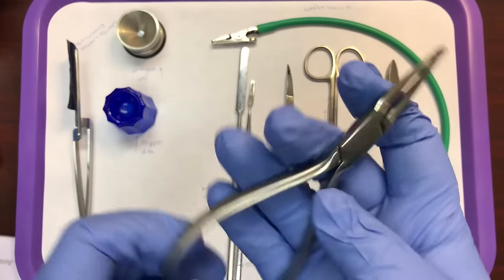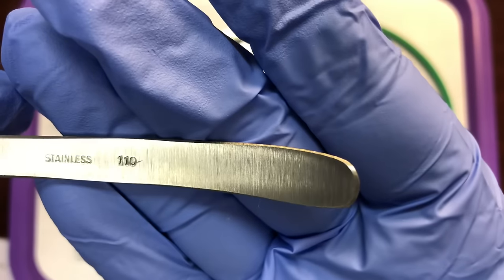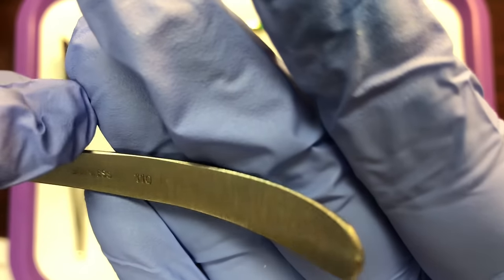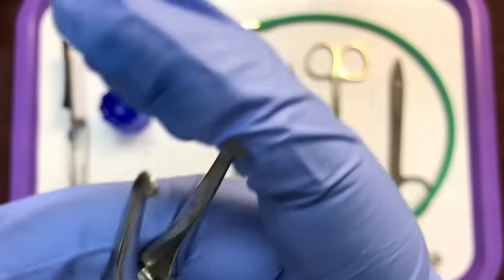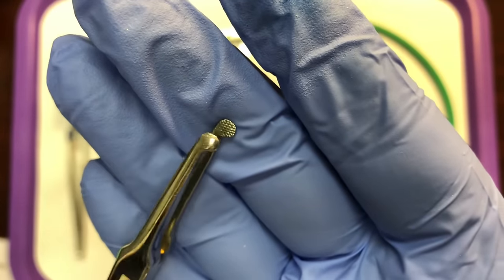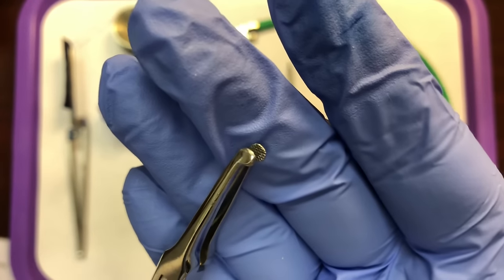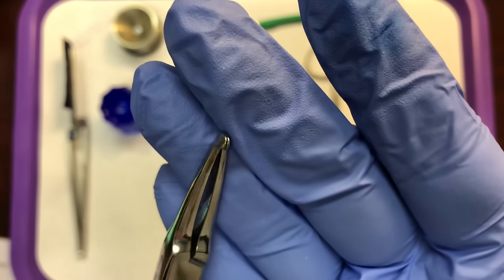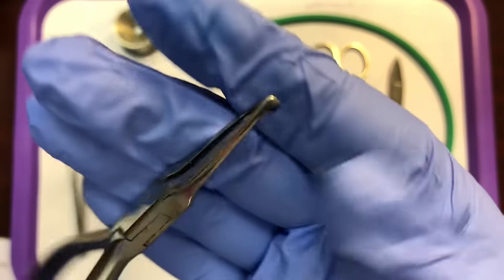Here we have Howe pliers, also called a 110. If you notice inside the handle, it has the imprint of 110, so you can call this 110 pliers or Howe pliers. Howe pliers are used to grasp small items, to bend wires and clasps such as orthodontic wire or clasps on retainers, or to grab hold of something that's hard to pull out of the mouth, like a wedge that might be stuck between the teeth.